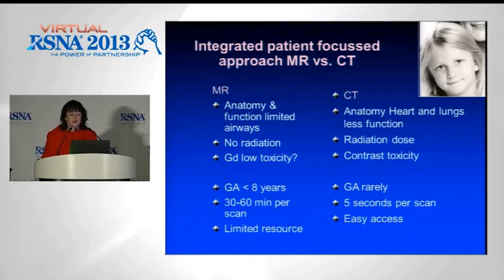because they are important. Clearly, cardiac CT comes with a radiation burden, and there is a very exciting launch of new machines here, a very dramatic increase in the technological advantages of CT with dose reduction and better quality imaging. Images that are fit for diagnostic purpose, that is, diagnostic, but at the lowest dose that you can achieve with good diagnostic imaging.